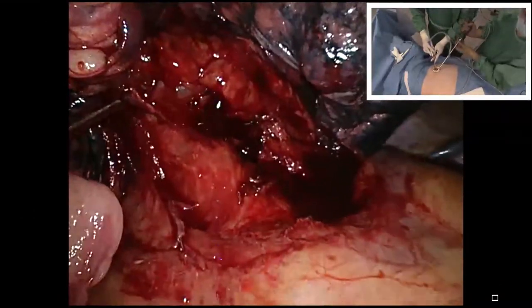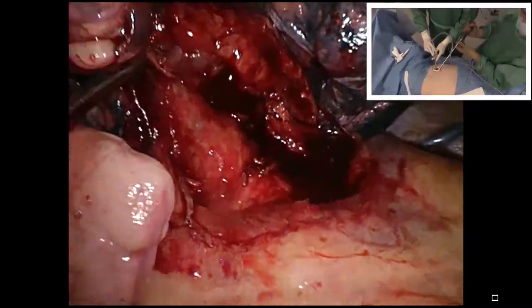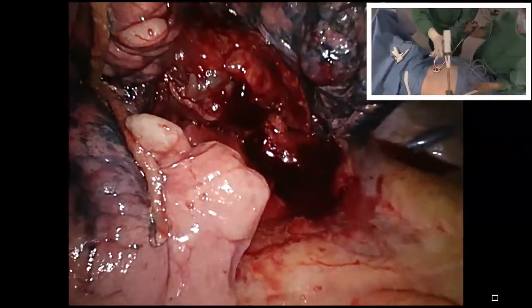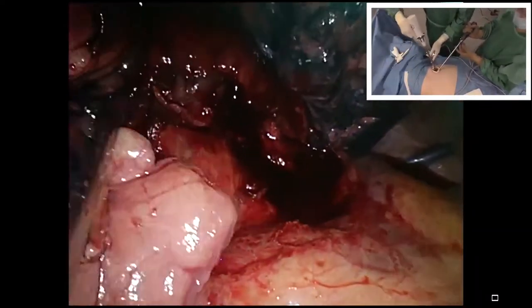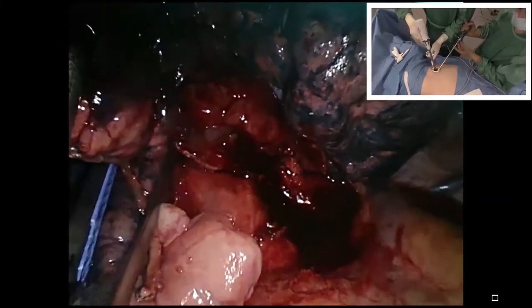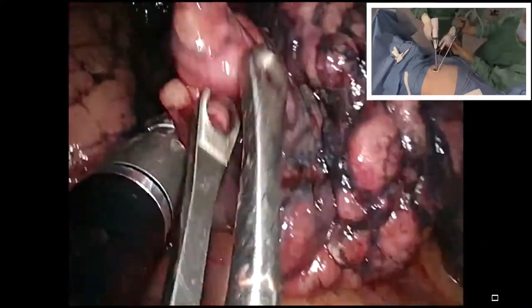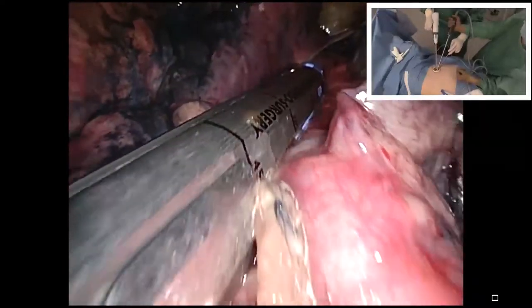Second shot, here, above the middle lobe vein and behind the vein. It will be better the 45, the 60. You see the angulation, always the angulation of the stapler. So you see it, Jens? We can see perfectly, yes. Okay, any questions? Not now. I think clear plane. Okay? Yes. Go.